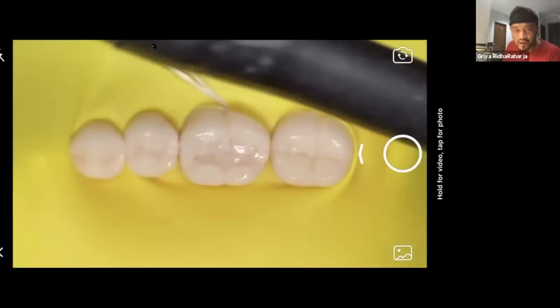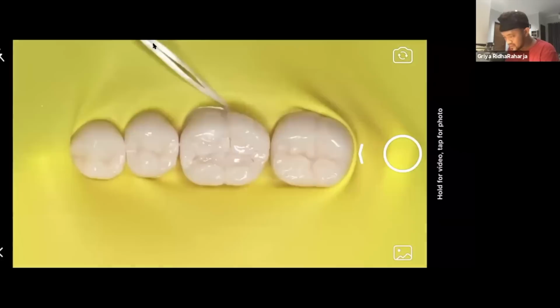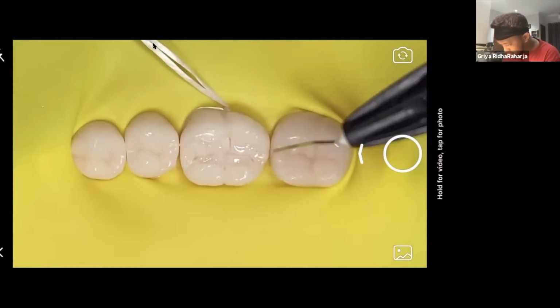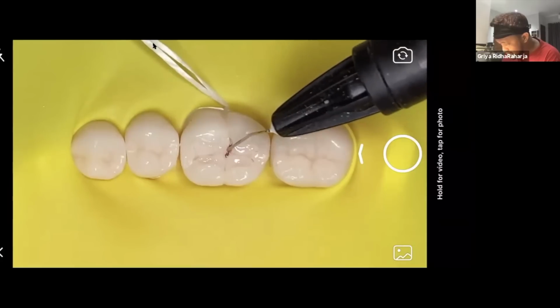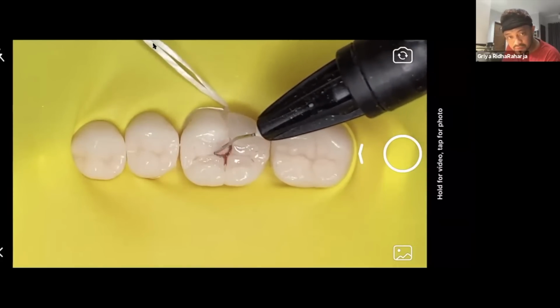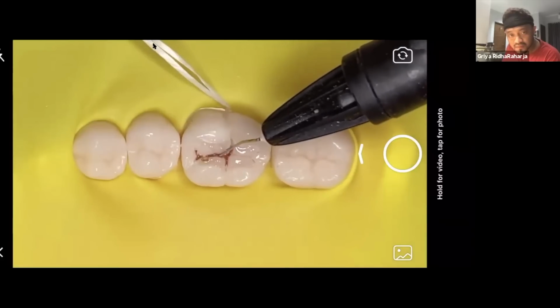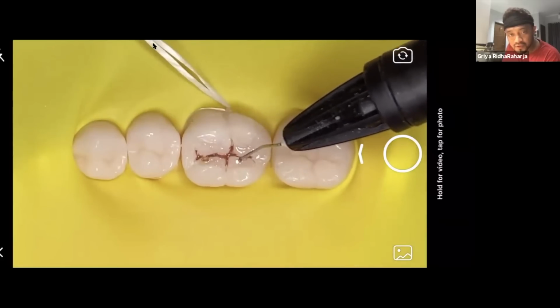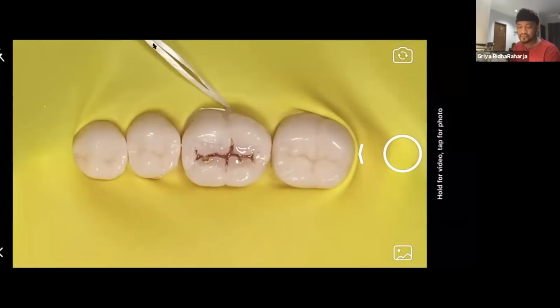This is the Ivoclar. There is no sign anymore because this is my old stain. Because the Ivoclar tip is very thin, very sharp, you can add the stain thin like this. Sometimes it looks very ugly, but after you clean it, it will be nice. Okay, this is dirty. Yeah, don't tell your patient, please.